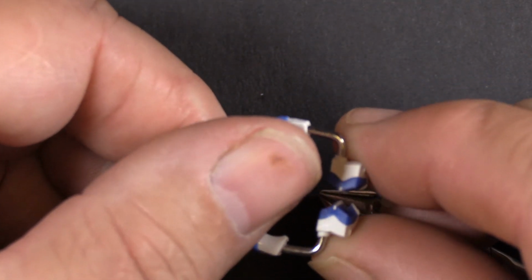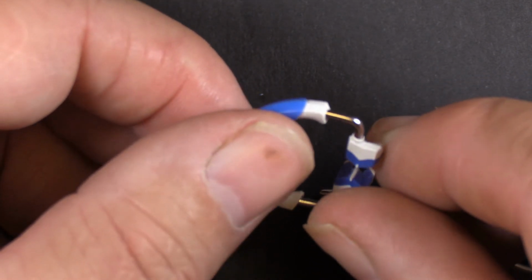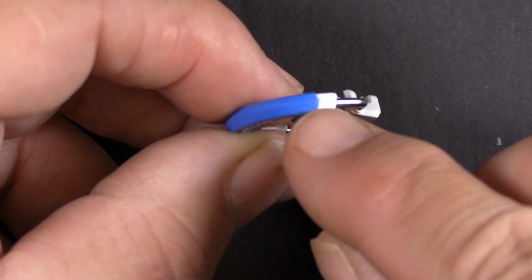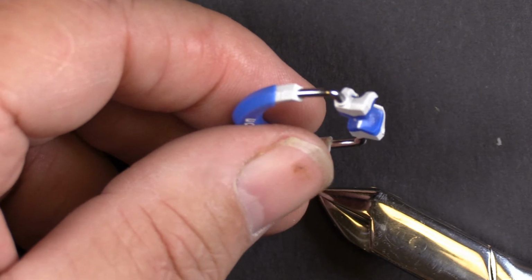So that is something I will kick over to our engineers to talk about, maybe doing a purple version of this ring where we've increased this angle to maybe 20 degrees for those types of severe instances. Again, when we're designing these, we're trying to hit a sweet spot where it's going to cover the vast majority of the restorations without creating problems with other restorations. So that's the curve of Spee issue.